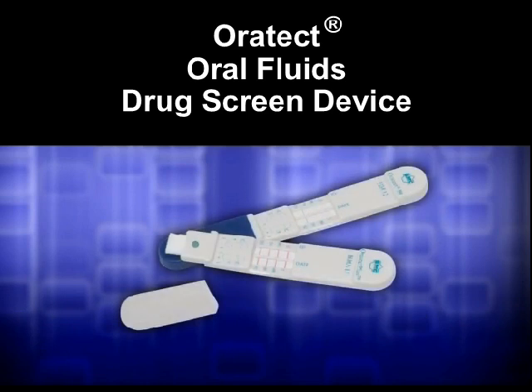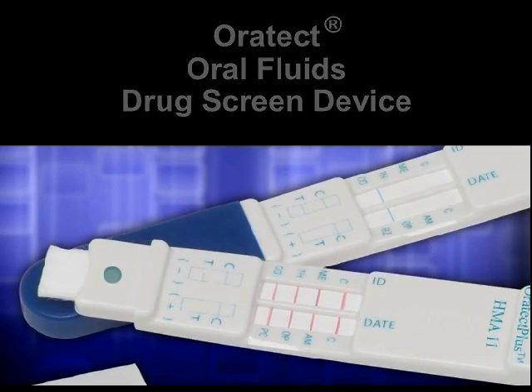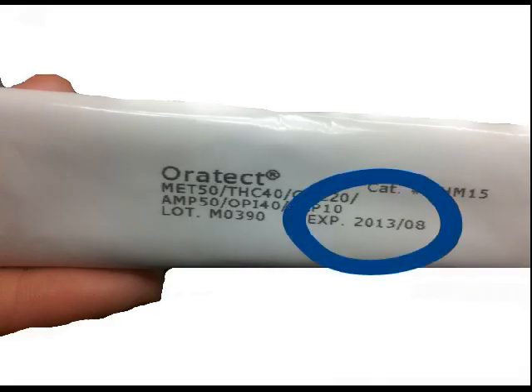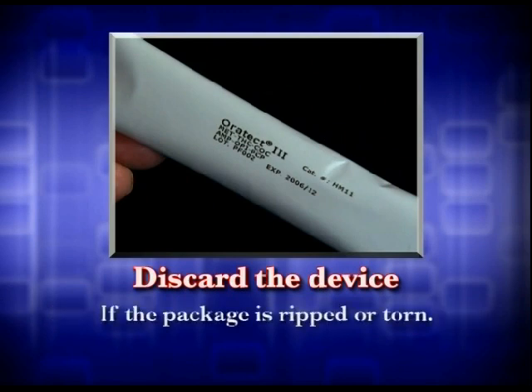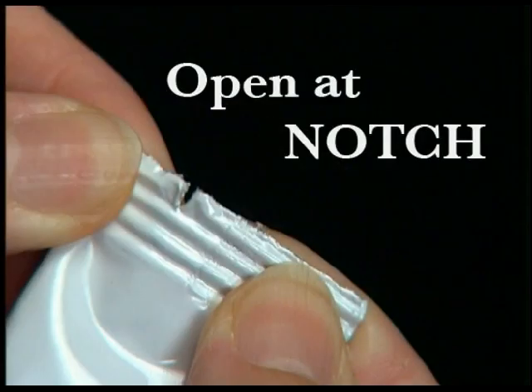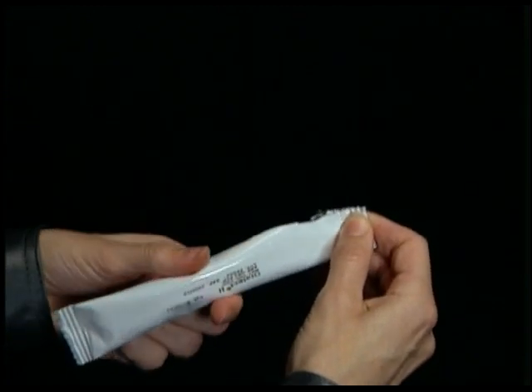As the test administrator, follow this easy test procedure for either Oratect or Oratect Plus. Before use, first verify that the expiration date on the pouch is valid. Discard the device if the expiration date has been exceeded. Discard the device if the package is ripped or torn. Then remove the test device from the sealed pouch by tearing at the notch and gently pulling out the device.